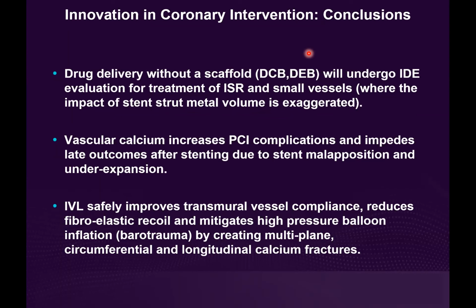It's 1 or 2 stent ISR. They're randomized 2 to 1 to either the drug-coated balloon or POBA. Again, we actually showed the Virtue study design probably 2 years ago. I think the first time I showed that was at CRT.